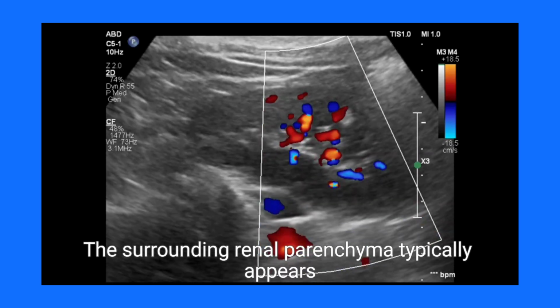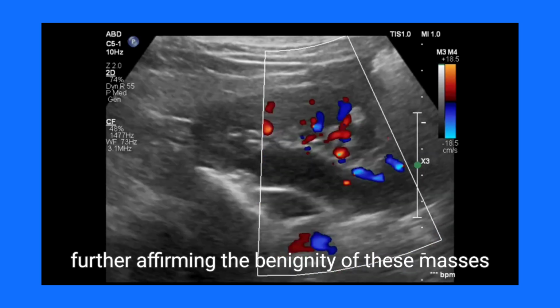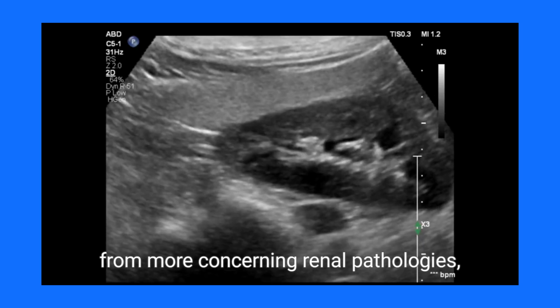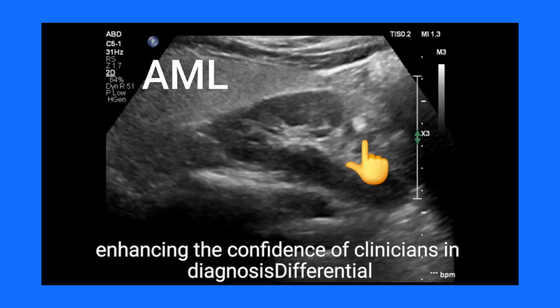The surrounding renal parenchyma typically appears normal, further affirming the benignity of these masses. This imaging pattern aids in differentiating AMLs from more concerning renal pathologies, enhancing the confidence of clinicians in diagnosis.